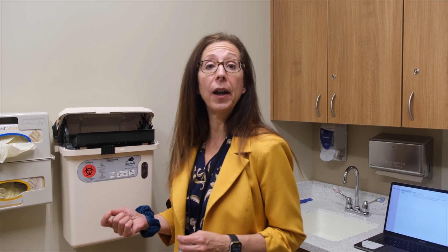I'm Barbara Miklitz, the Medical Director of Pediatric Bone Health for Morristown Medical Center. We are going to show you some clips of children getting their casts on and off, since we know that this can be scary. And we want to show you that it really is nothing to be scared of.